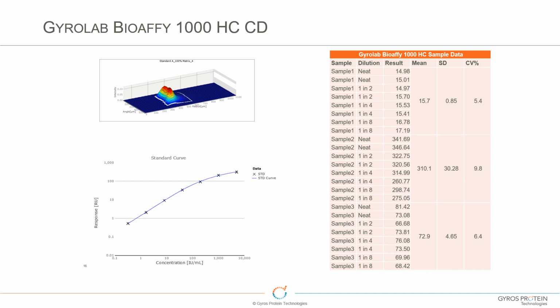And we know from our customers that so many customers want to use neat matrix because they want to measure free. Yeah, exactly. And as we think about adjusting the analytical range of the assay, that's why people want to stick with the HC beads across all of them. It wasn't as critical for this particular assay, but it's one of those discussion points that we have with customers. We have many customers that have requested the 200 HC CD, which is currently not available. So it's something that obviously we need to think about in the future.